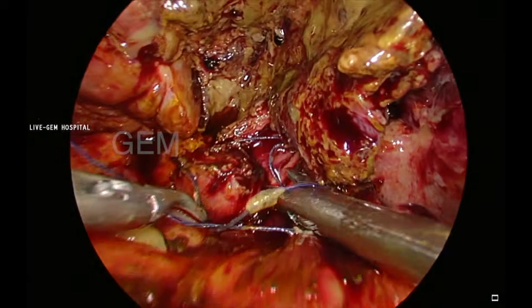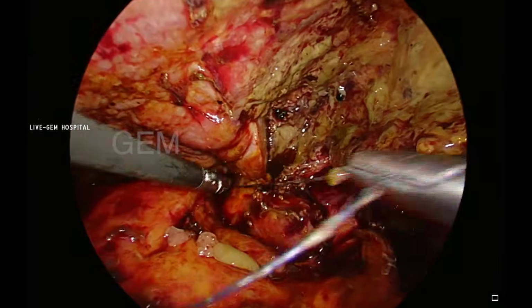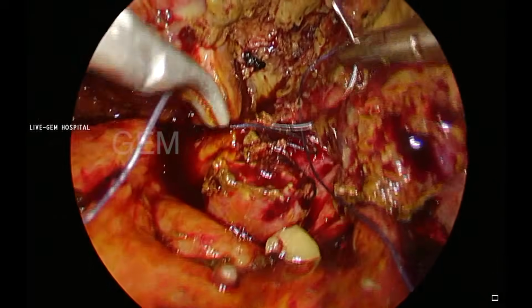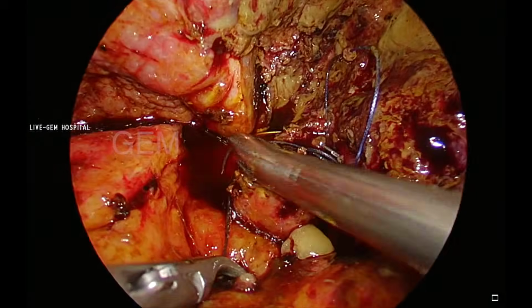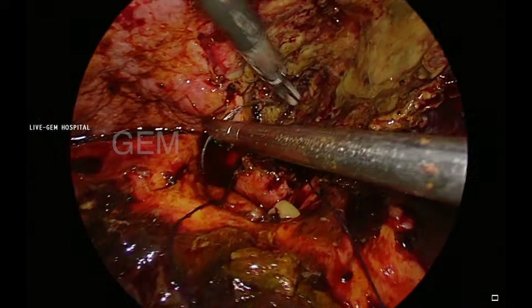See, you can see the bile is coming out. You can see the bile is coming out now. So that means there is no stone, all the debris material is released. And I have started suturing the posterior wall along with the infundibulum of the gallbladder.